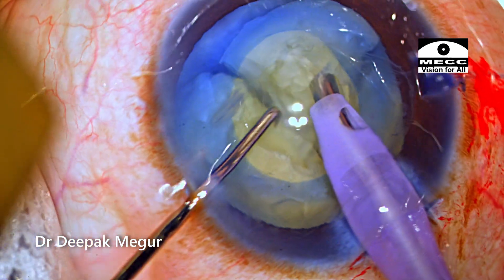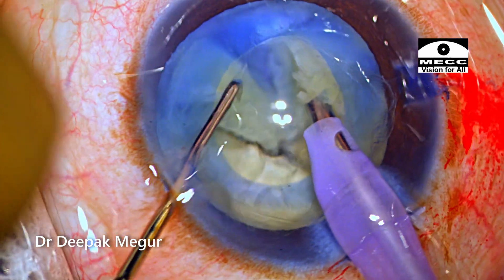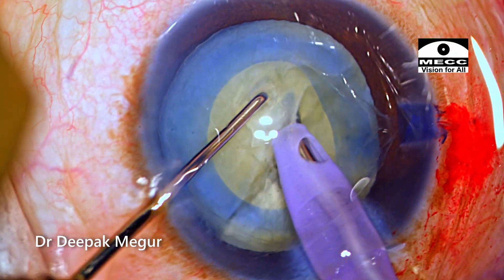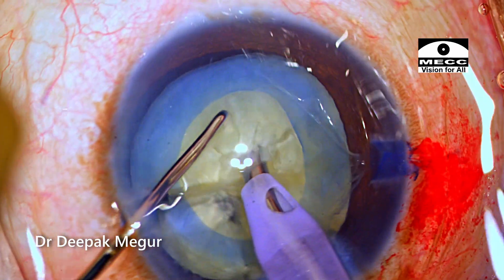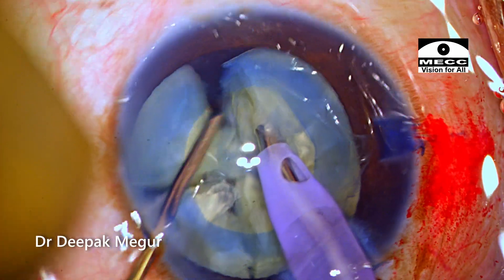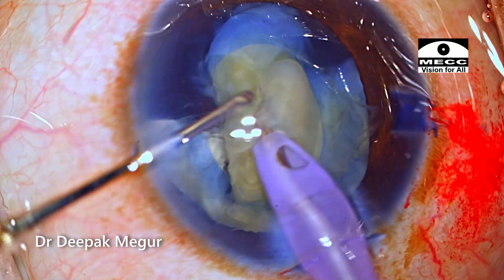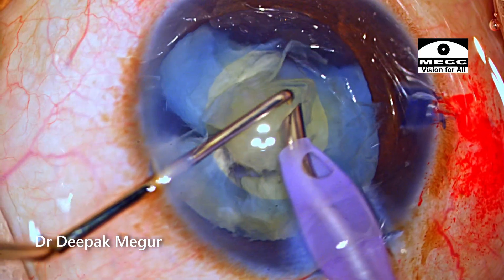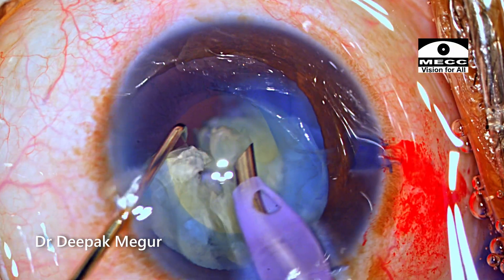If you want to divide the nucleus without any excessive lateral movements, it is possible. The only trick is to place your second instrument deep down, near the posterior plate. If you follow this simple principle, nucleus division can be achieved without using any excessive lateral forces. All the nucleus has been divided into smaller fragments, and each fragment is being emulsified at the plane of the rhexis margin. Care is ensured that the plane of emulsification is much posterior — at the level of the rhexis margin — which will ensure that the corneas are crystal clear on the first post-op day.